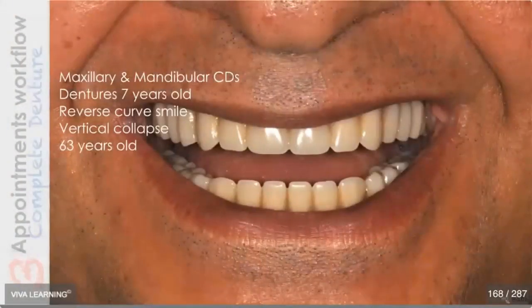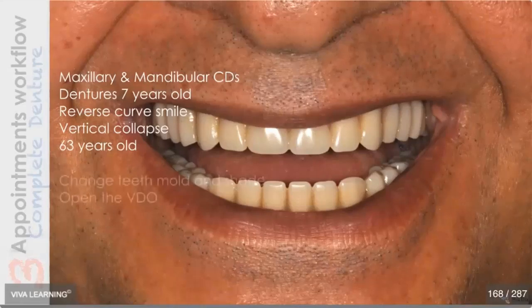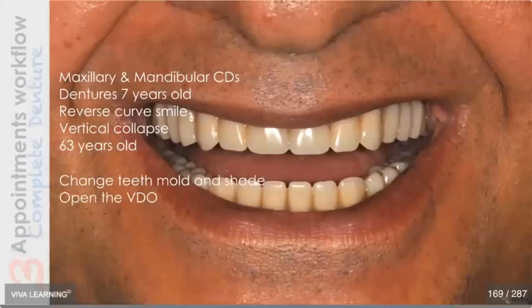This is another case, 63 years old, has maxillary and mandibular complete dentures. Dentures are 7 years old. He has a reverse curve smile, a vertical collapse, and he's not happy with these dentures. He wanted to change the teeth mold and shade. Not so much the shade as the shape of the teeth.